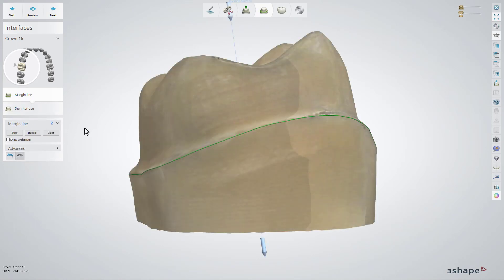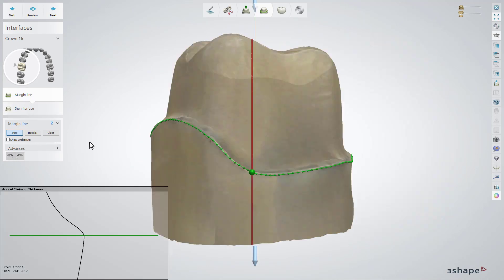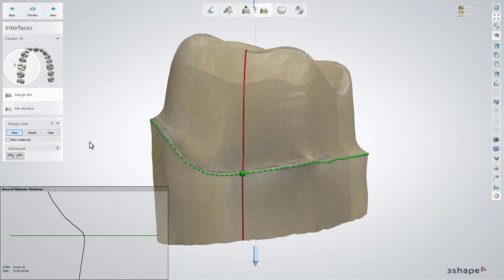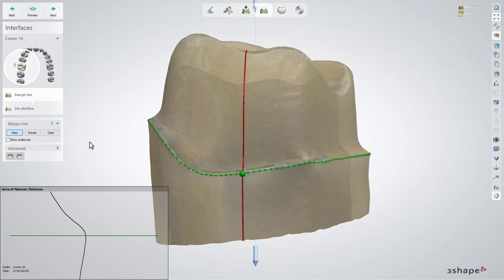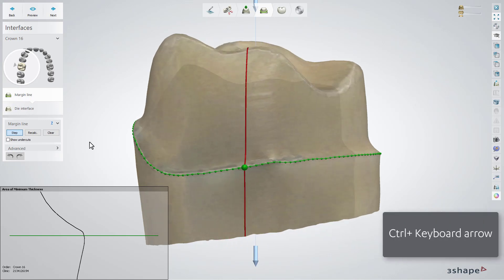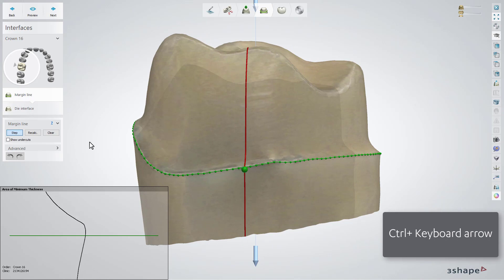Press the Step button to move the points on the spline by using the Up, Down, Left or Right keyboard arrows. The active green point turns red when you move it into the undercut area. If a point needs to be moved a long distance and faster, press the Control button and a chosen keyboard arrow: Up, Down, Left or Right.